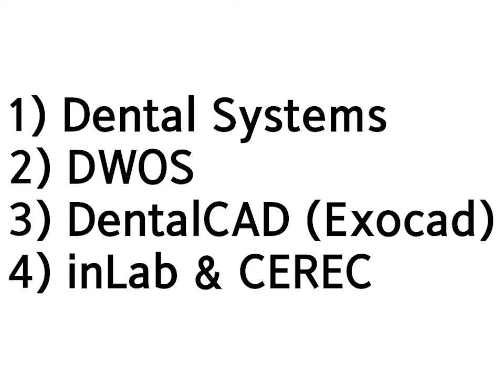Dental System is available for purchasing in different versions, from a premier version that includes all the modules to more basic versions. Recently, 3Shape has created a specific design software for clinicians known as the Dental Studio. The software is intended for designing simple restorations that are manufactured with chair-side milling units in a single appointment.